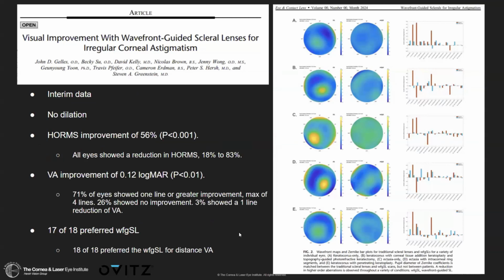Yeah, and this is happening with a lot of patients worldwide. So we get a lot of doctors from Palestine, a lot of doctors from Turkey, from Oman, from Saudi Arabia, and they report the same issue. They try two, three scleral lenses, and they still get HOAs. So we get a lot of Pentacams and a lot of other aberrometry readings, but it's present. We see it a lot in scleral lens patients.